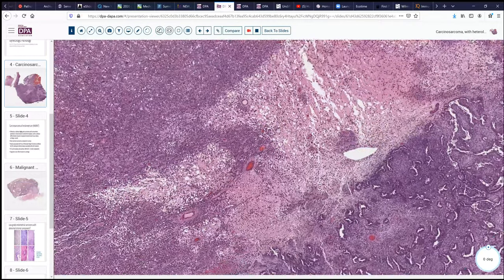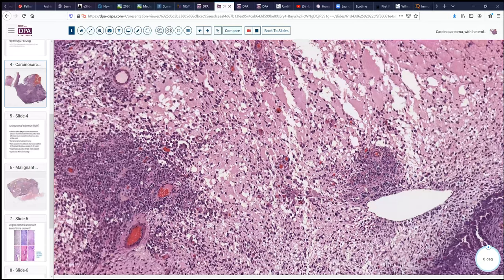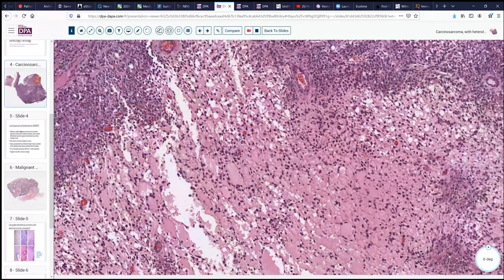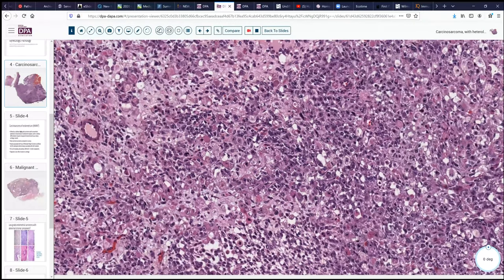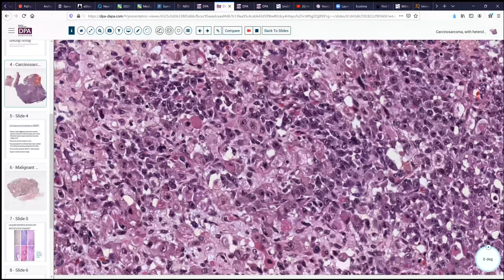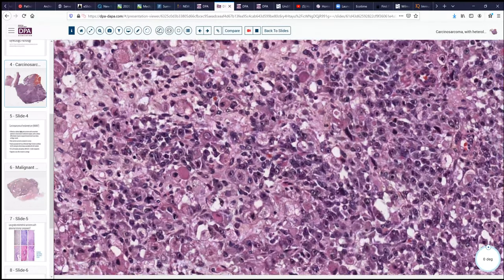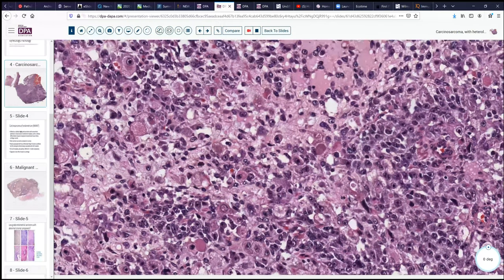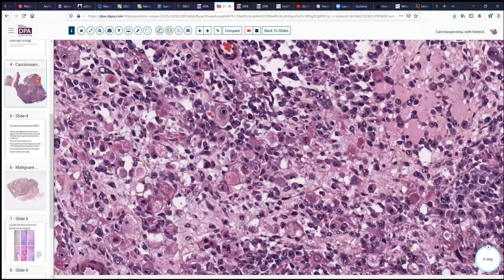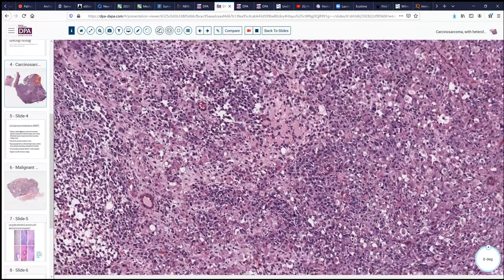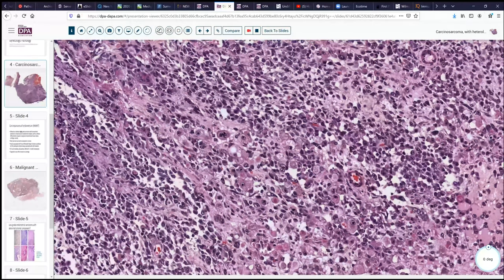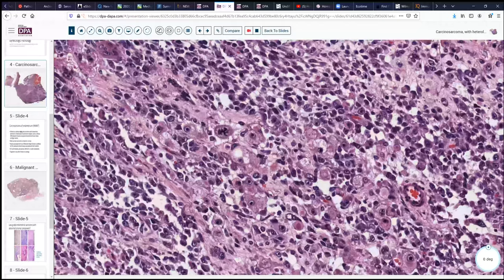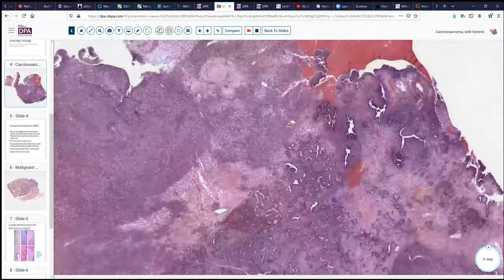We'll look at these other more loose mesenchymal elements here. Sometimes you can find cartilage in these tumors; occasionally they'll even form osteoid-type areas. If there's a question, we may want to do smooth muscle or skeletal muscle markers such as myogenin or MyoD1 to see if these are in fact strap cells not showing us clear cross-striations. Occasionally you'll see strap cells with good cross-striations and then the diagnosis can be made without special stains. We note that in this more sarcomatoid component we do have atypical mitotic figures, and that makes the diagnosis of carcinosarcoma fairly straightforward.